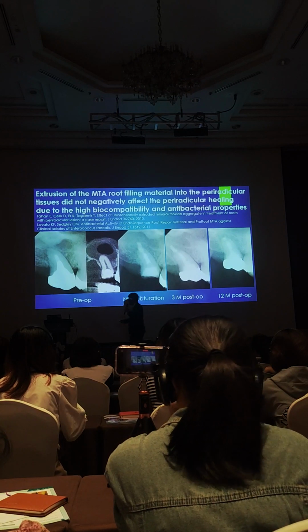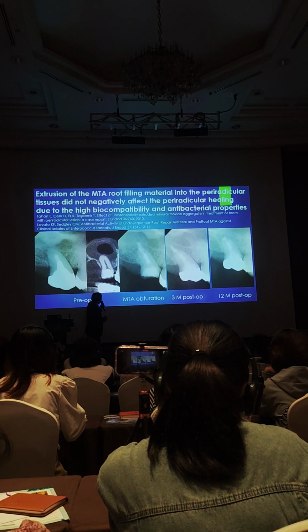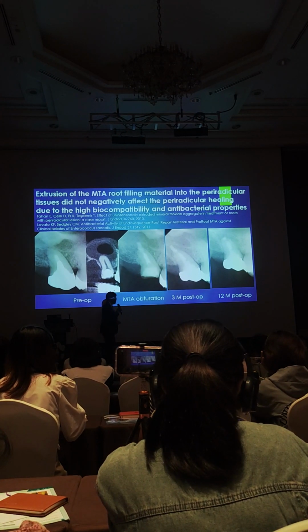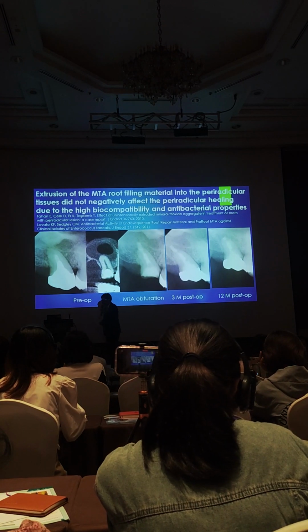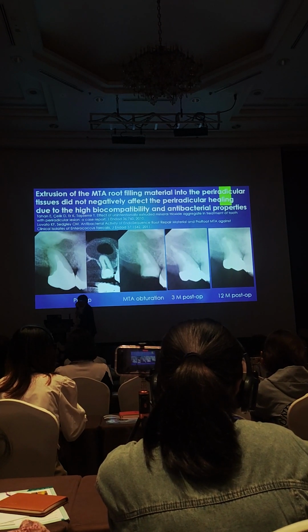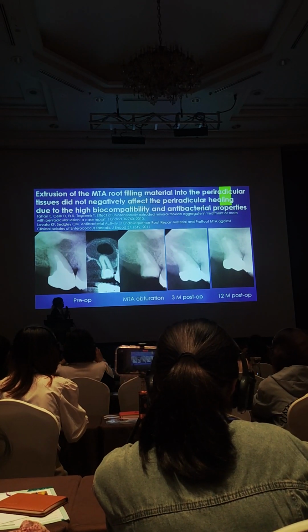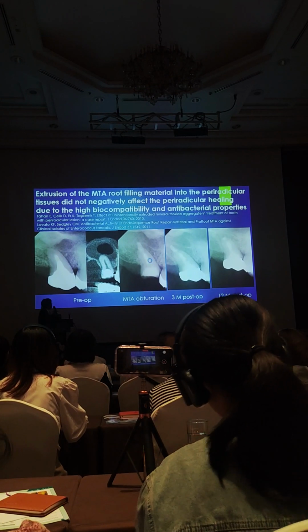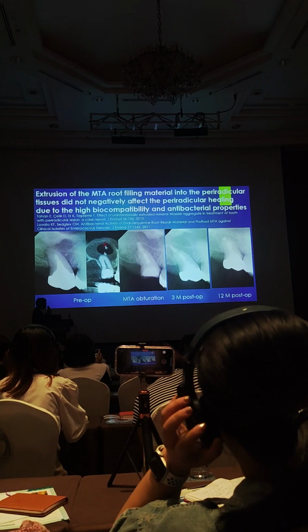If I had extruded gutta-percha filling into the sinus here, what do you think I would get? I would get another issue, like aspergillosis. So don't use gutta-percha in retreatment cases, especially like this, if you see the lesion in the sinus cavity.